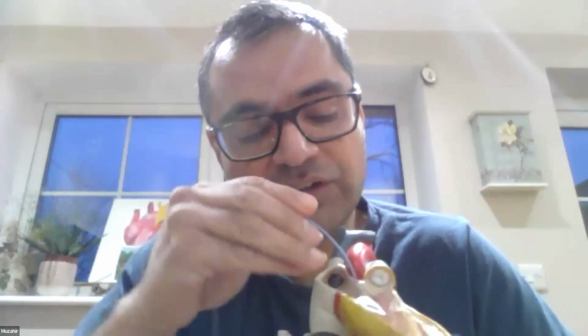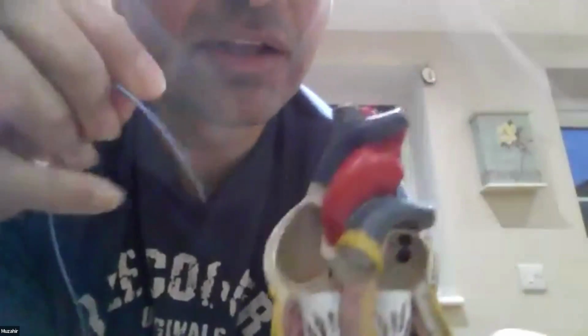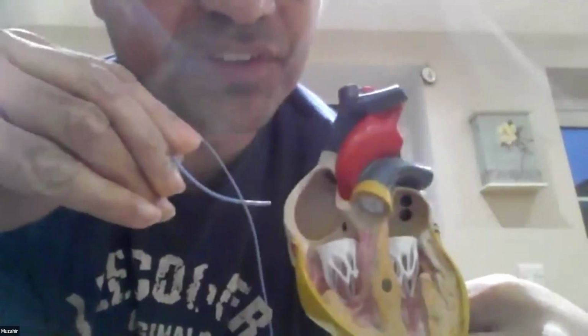So if I can just show you my little heart model, I just want to check with you guys whether you can see things clearly. So the structure at the back. Can you hold it a bit higher? Yeah. Thank you. Right, let me get close to the screen. This is going to be slightly challenging, but anyway, I'll put it in an AP position.